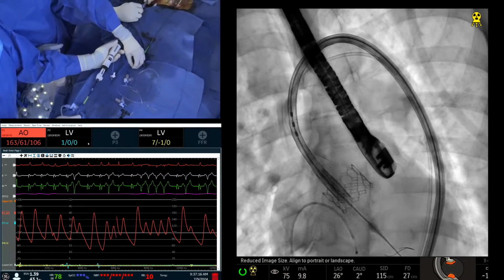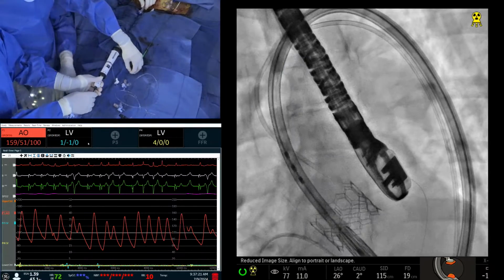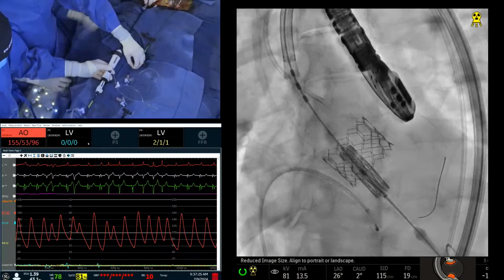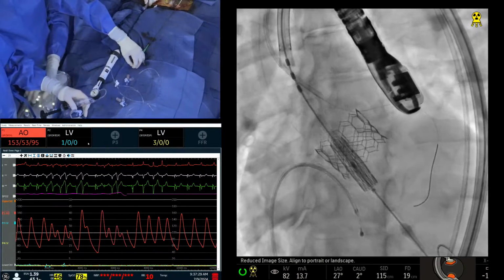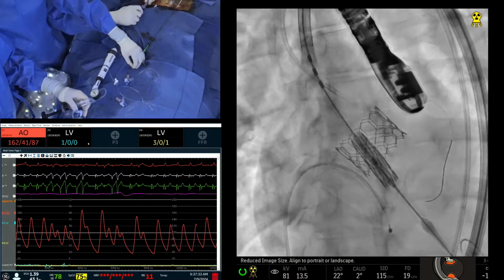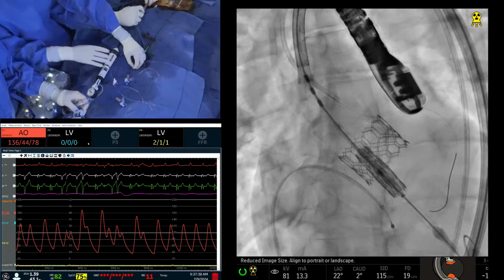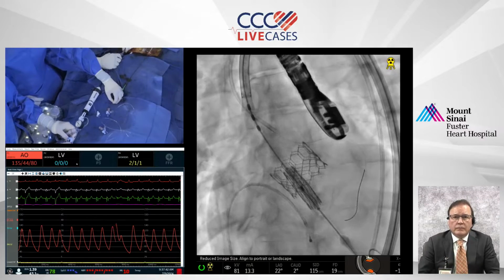Wait, everybody wait. Can we magnify more, guys, so we can see a little better? Before that, go save, please. We didn't save fluoro. Okay, one second. So you see the upper diamond. We have I guess 1/3, 2/3 of that upper diamond. Is that correct? What about impinging into the mitral valve if we go too deep? No, it's going to foreshorten away. Okay. How do you like the position?